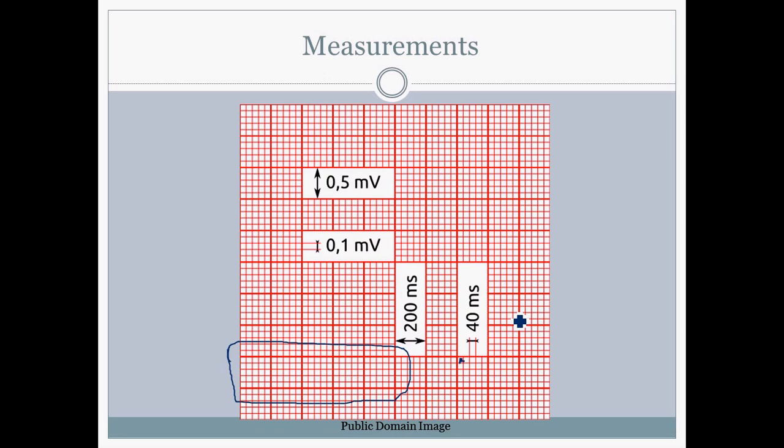Millivoltage, not entirely that important at this point. There may be future lectures that stress more of the importance of millivoltage. Some people will have more conductive skin. They'll be especially sweaty.